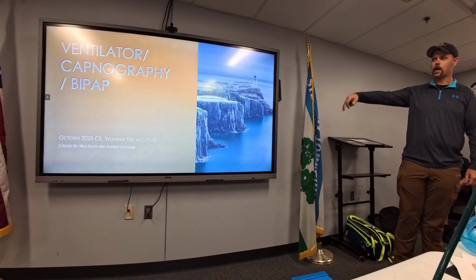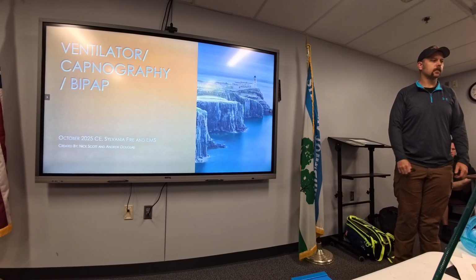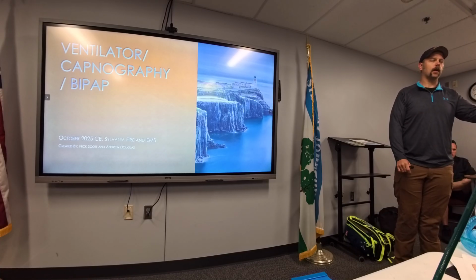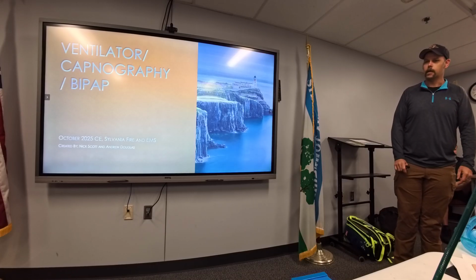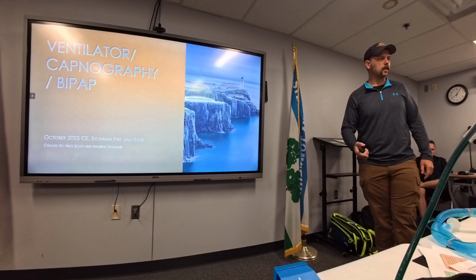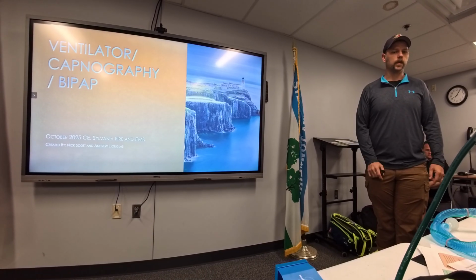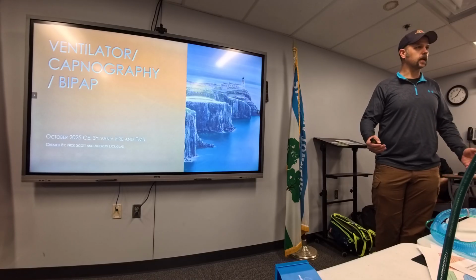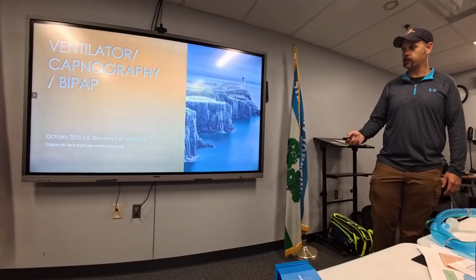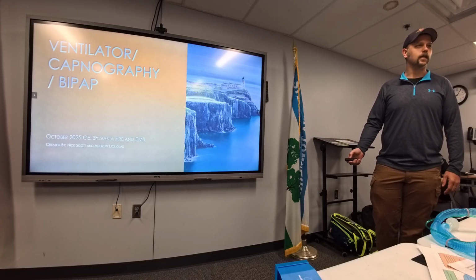We're going to go through a quick PowerPoint, and then we're going to be putting our hands on the vents, because it seems like everybody has questions about how do I make it stop beeping, how do I do this mode, how do I do that. And then we're going to go over the BiPAP protocol. We have masks here, so if anybody is willing to put a mask on, see how it feels, that way when we get our patients we can teach them how it's going to feel, how it's going to sound, things like that.